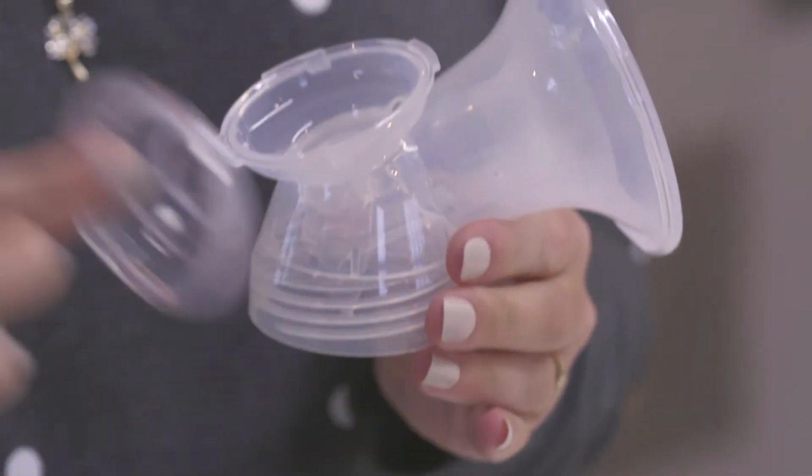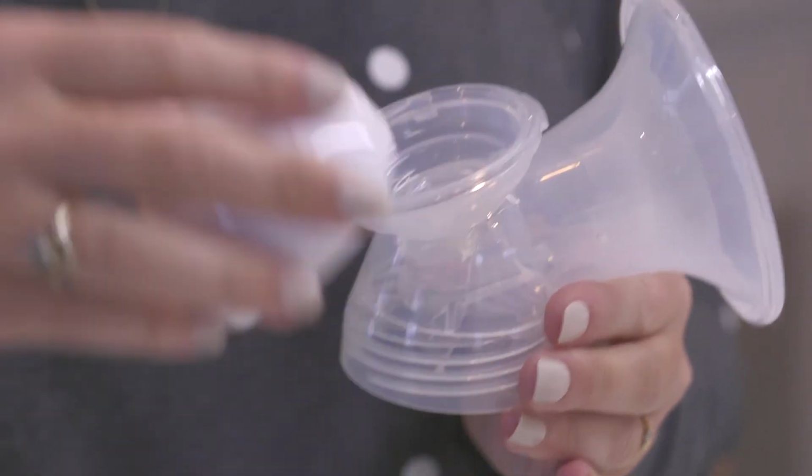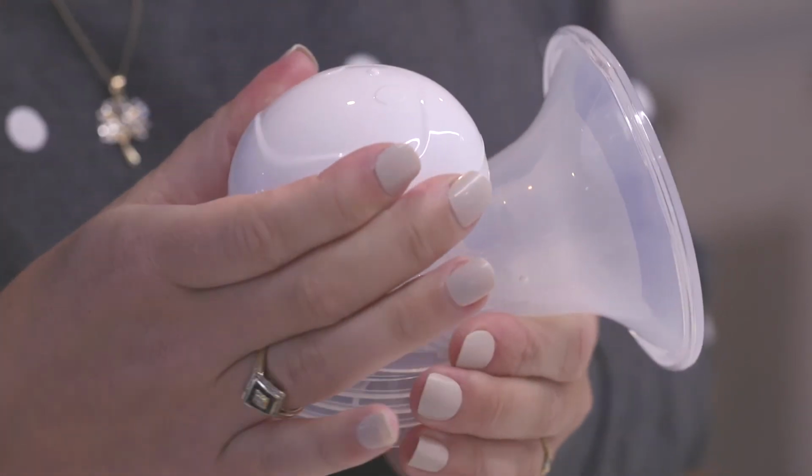Take your diaphragm and place it in the top, and the cap screws on top of there.